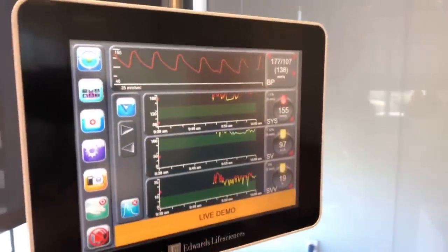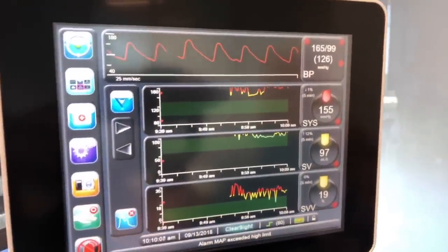That's assuming it's not just throwing all the data at you, like every second you see what the blood pressure is. For example, right now, I'm on this ClearSight monitor, and I have a full stream of blood pressure, 137 over 84, up to 161 as I point it up there, up to 177 as I watch it, and then I stop watching it and it goes down. And that is an accurate blood pressure when I do a show, guys.